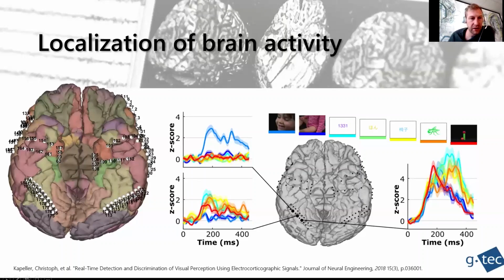And if we now want to understand, for example, the visual fusiform face area, then we can see here that this visual percept, when we show faces, is only firing for face percepts, but not for any other visual category. So this is very specific for faces, and now we can see that this is actually on the fusiform gyrus.